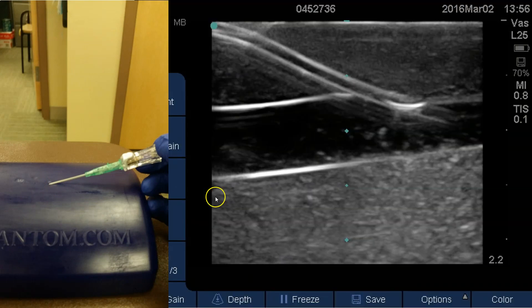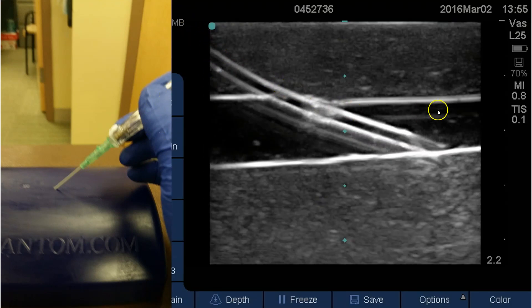The next common issue is the angle of attack. When placing a non-ultrasound guided IV, most people go in nice and shallow, which works great for a superficial vein. But when you have a vein that's rather deep, going in too shallow means you'll barely get your catheter to where you want it and run out of space — this is a catheter very likely to fail. This goes back to needing a long catheter, but also needing a steep angle of attack. If you have a steep angle of attack, you'll discover you have significantly more catheter in the vessel, making the IV much less likely to extravasate.